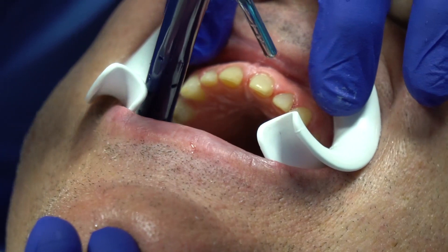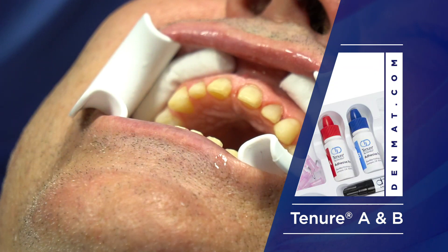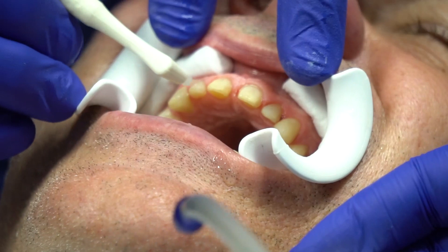Now we want to look for an etched surface everywhere. We're going to use Tenure A and B — that's the system. It's mixed equal parts. This is an older Bowen-based system; it's been around many years. We want to use a large white brush. If there's a little moisture on the surface, it's okay because it's an acetone solvent-based system and it'll suck the moisture off the tooth.